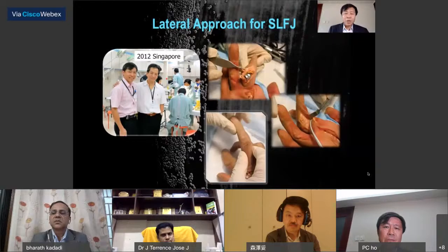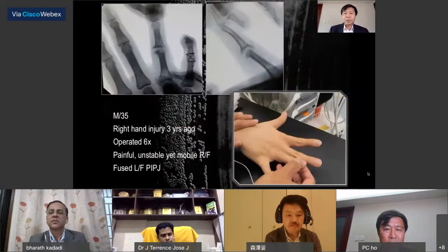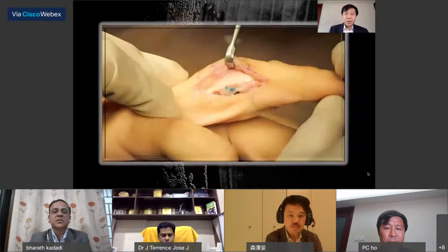This is a young, 35-year-old gentleman who suffered a severe hand injury 3 years before, been operated on six times, still resulting in a painful, unstable, but yet mobile ring finger. And he obviously does not want to have a fusion because he's already fused a little finger. So we went into the joint replacement using the lateral approach, opened the joint, and then detached the collateral ligament from the origin at the proximal phalanx, and then we can flex the finger. We can do all the bone carpentry through this approach quite easily. At the end, we fixed the collateral ligament with non-absorbable suture.